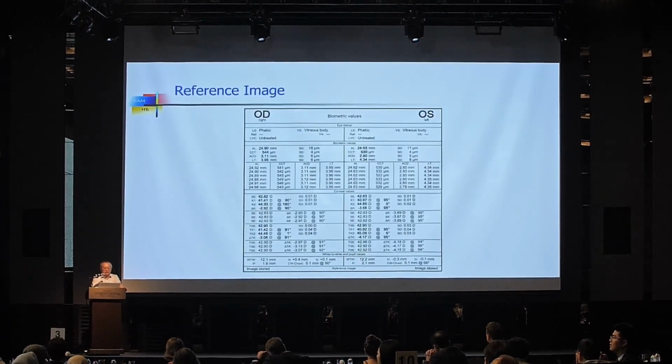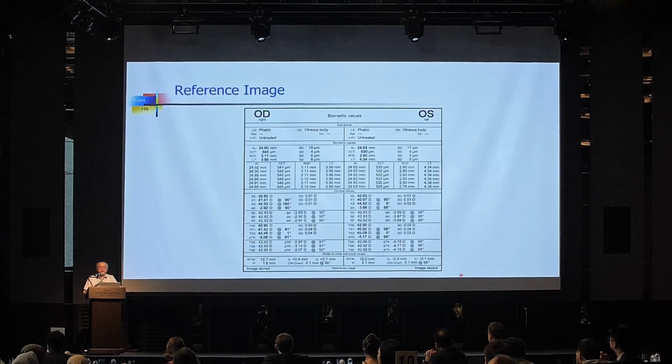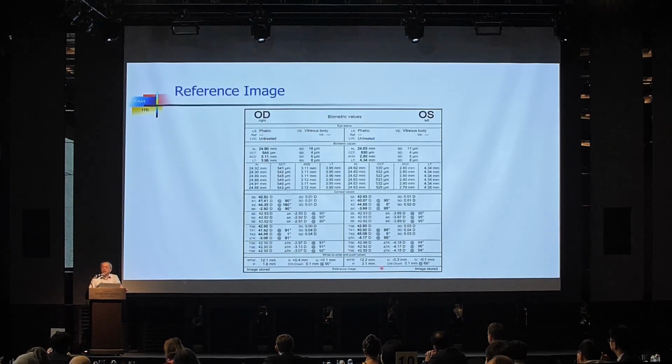Of course, the reference image is down here. I make sure I have this because I use Callisto. This is important because without this, you cannot align the eye intraoperatively with Callisto. If you have this, well and good. I'm very happy because then I do not need to manually mark the eye.